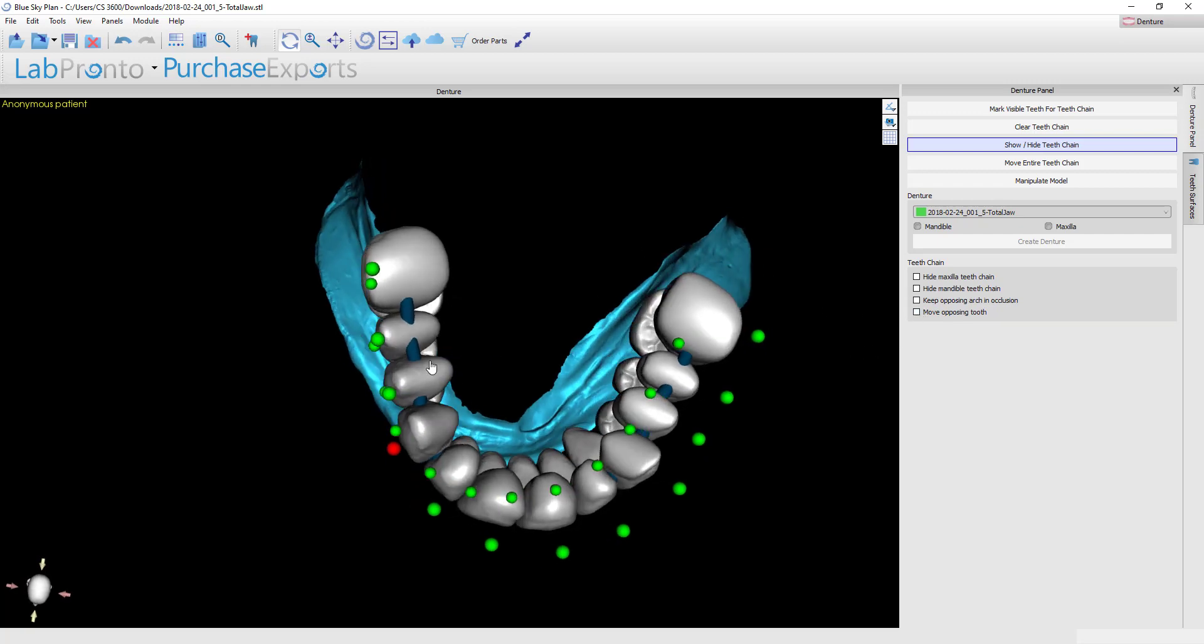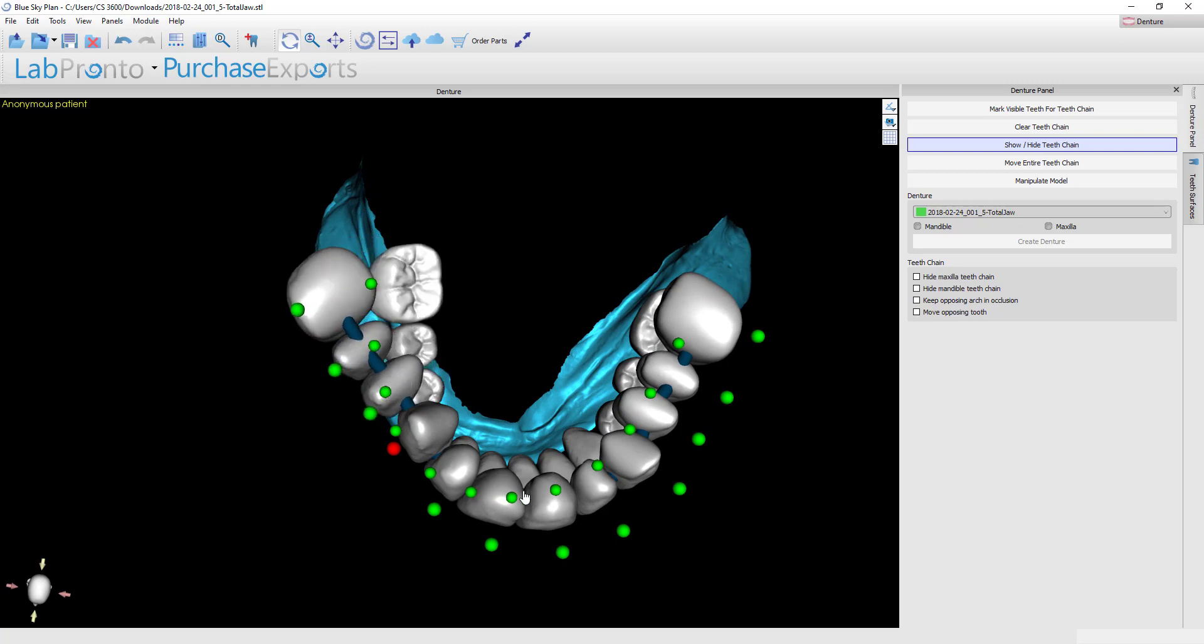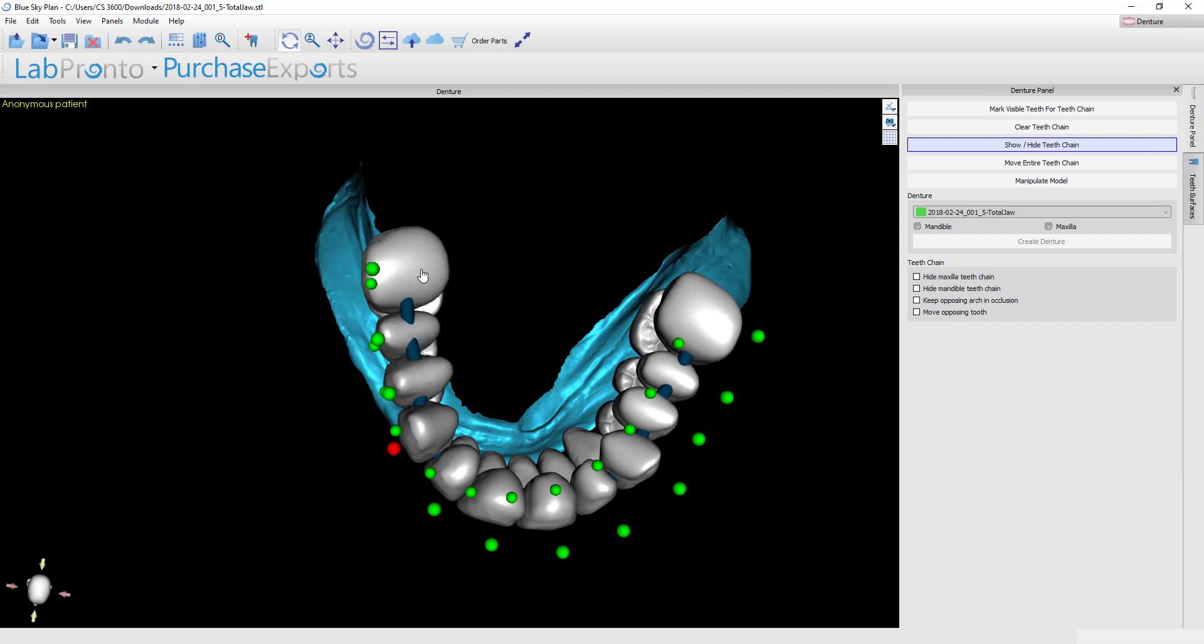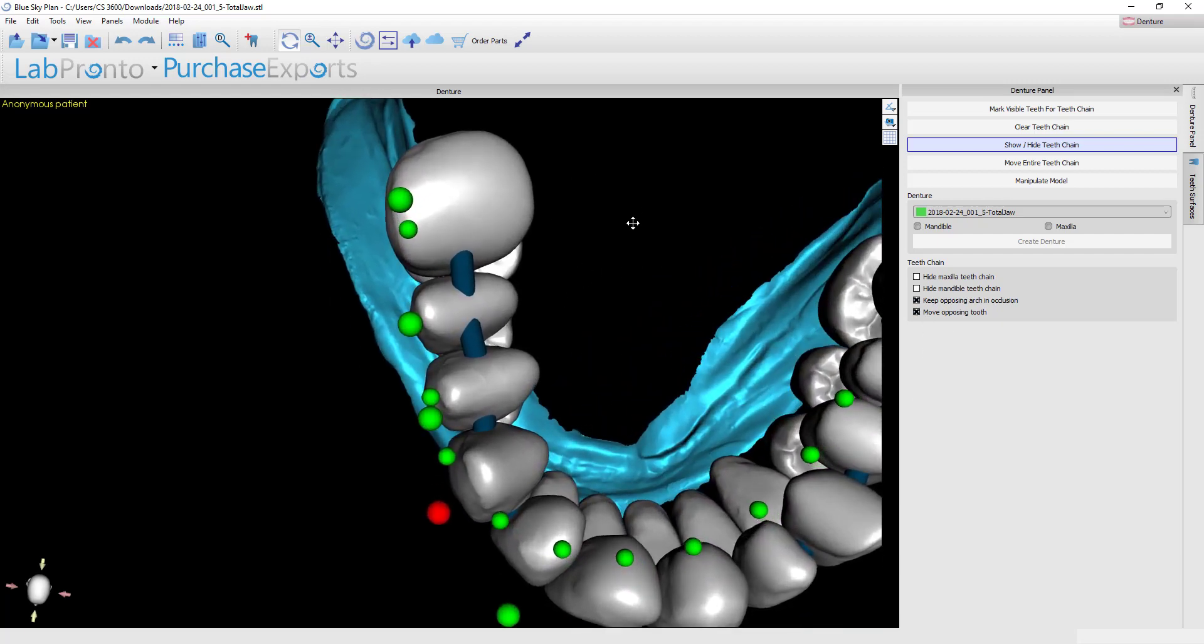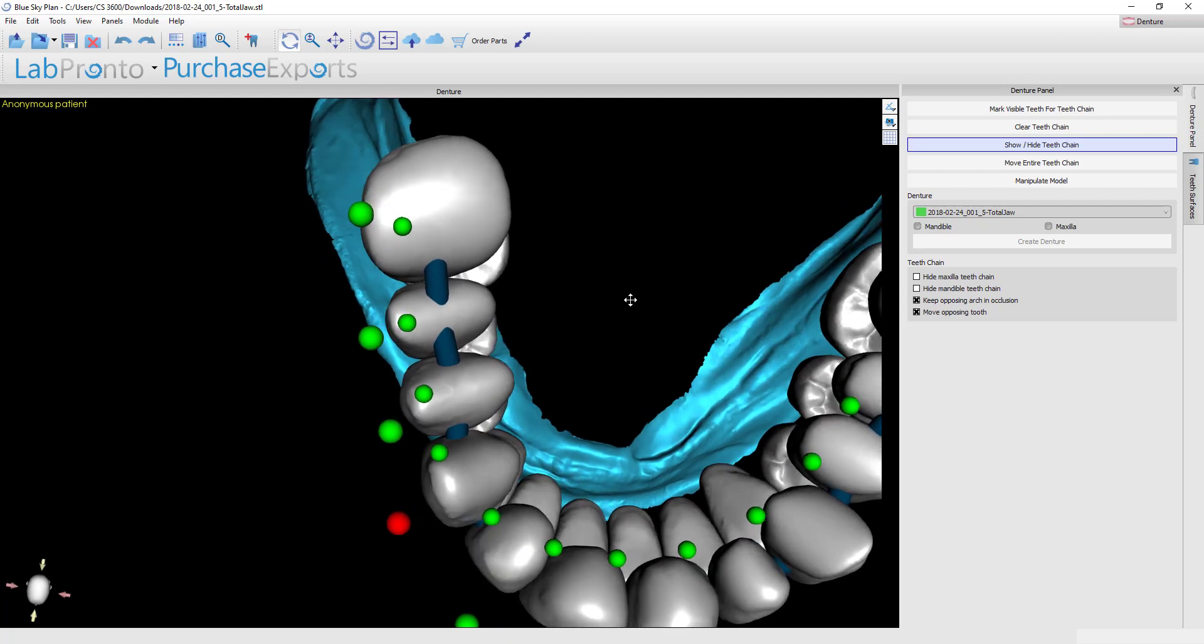If you don't have that on, let me show you real quickly. If I now was to hinge these upper teeth, you see that it leaves the lower teeth behind and you lose your occlusal relationship. We don't want to do that. I'll hit Ctrl-Z to undo that. You want to check the button on that says move opposing tooth and now we can hinge the entire posterior quadrant.